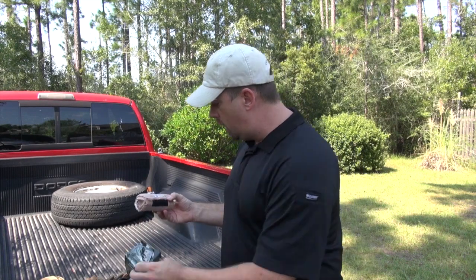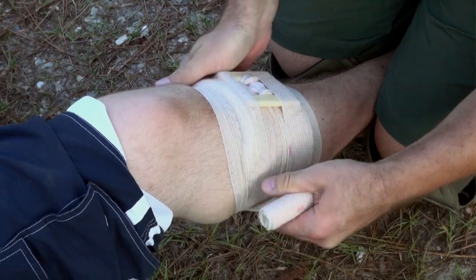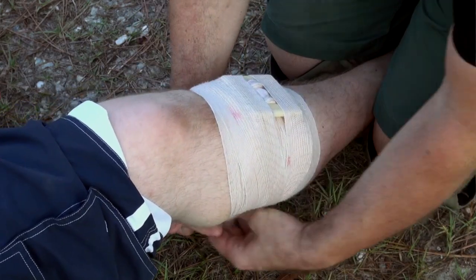This pre-made pressure dressing right here comes from North American Rescue. It's got a blood soaker right there, it's got a plastic material, and you can wrap somebody's wound up nice and tight.